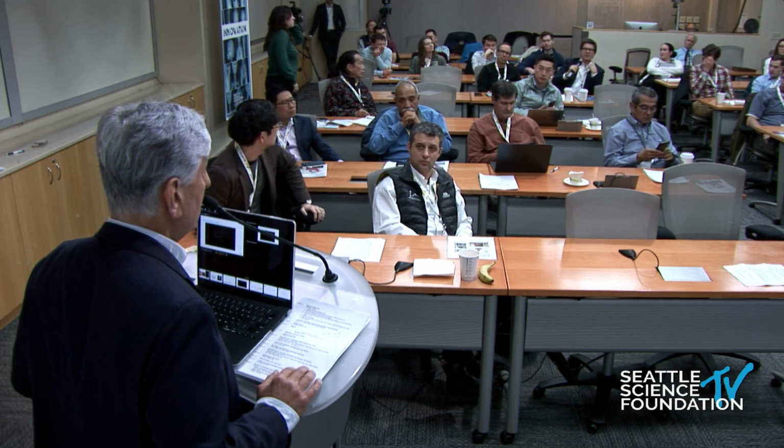Any other questions? Yes, sir. So if they take the post-auricular part of the hearing aid off, like at night, how much hearing loss do the lenses cause? Lenses don't really cause any hearing loss. Maybe a little fullness or something is there. So they can still hear their alarm in the morning? Oh, no question, because it's a fraction of 1 millimeter that's touching the umbo. So most of that ear lens is just on the ear canal. It's not touching the eardrum at all.